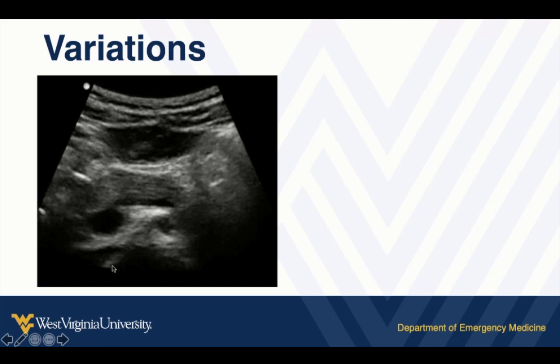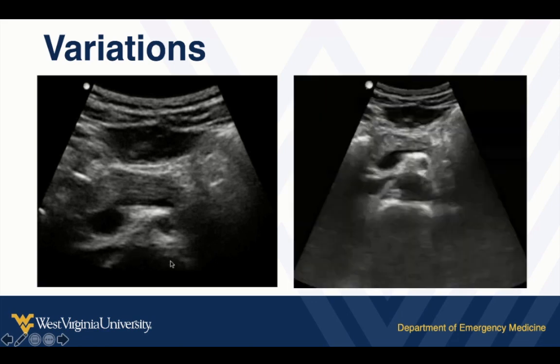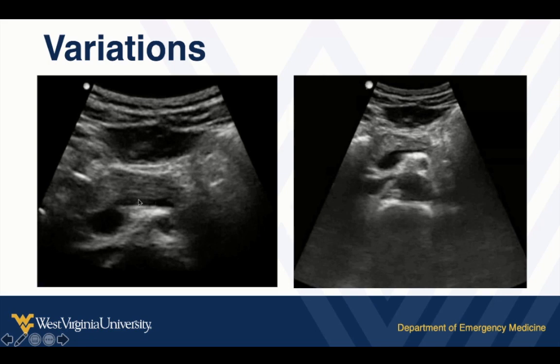Here's another variation — it looks like the abdominal aorta with what appears to be the spine behind it, but our depth is too shallow. When we correct our depth, we see the spine further back. This is the abdominal aorta, and this is the superior mesenteric artery. Make sure you have enough depth — even err on the side of excessive depth to find the spine. Recognizing that the splenic vein is visible here would also be a clue that we're imaging too superficially.